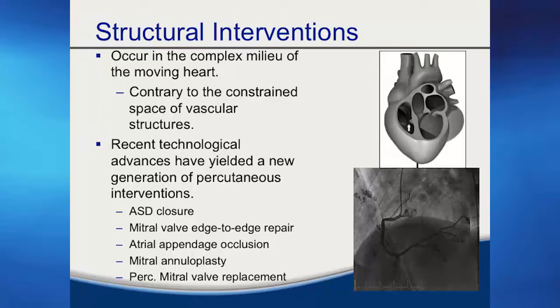This is kind of an old slide for me, but structural interventions are unique compared to what had been going on up to the early to mid-2000s, because vascular structures are constrained, and there are only so many ways you can go before you start going outside the vessel. In order to know what you're seeing and see what you're doing, 3D is extremely important, the key to success.